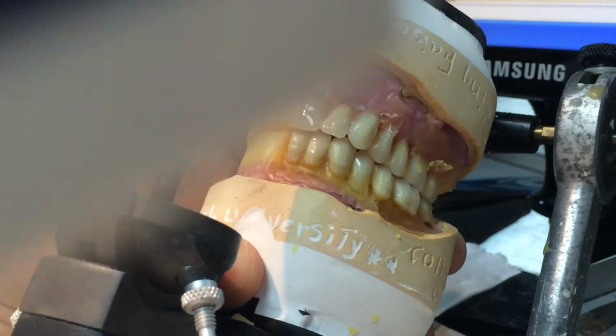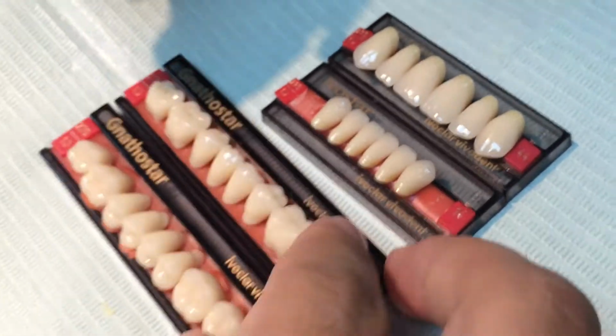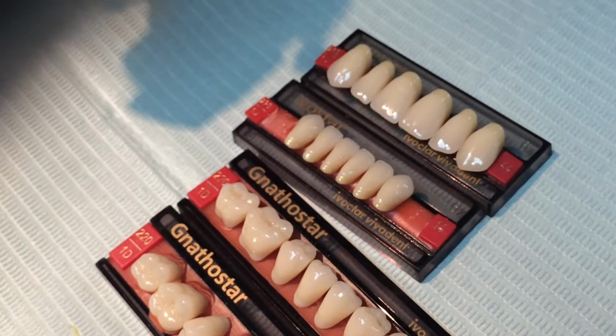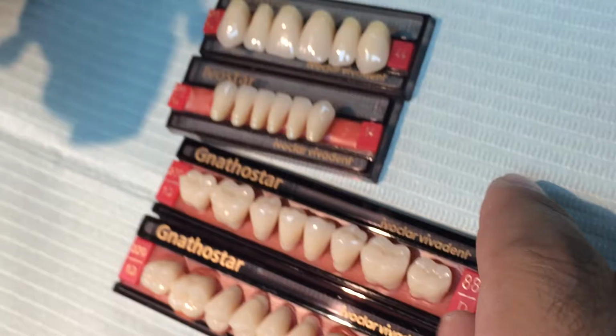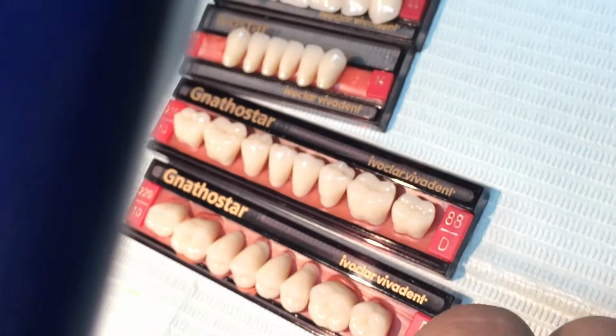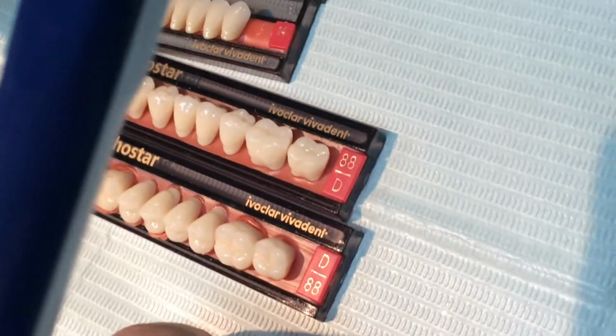These are anterior, you can tell, right? And these are posterior. To make sure if it's posterior, anterior, upper or lower, left or right, all you have to do is find the numbers and letters and put them in a way that you can read them, like what we have here. I can read them, right?